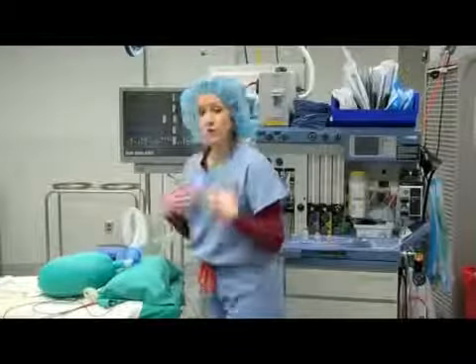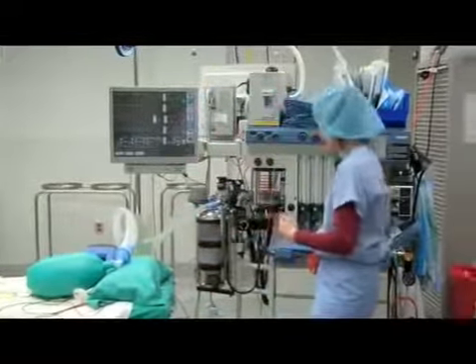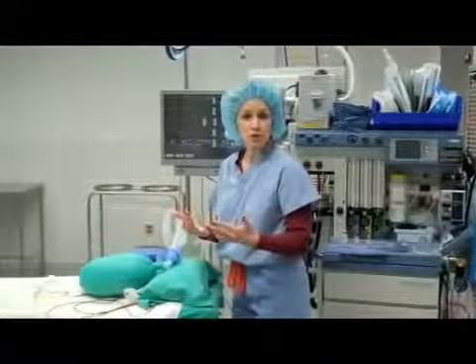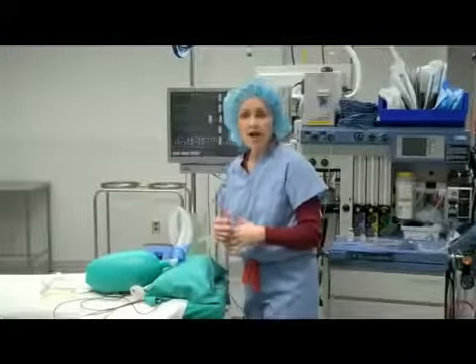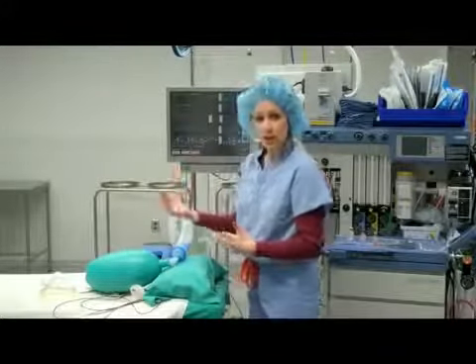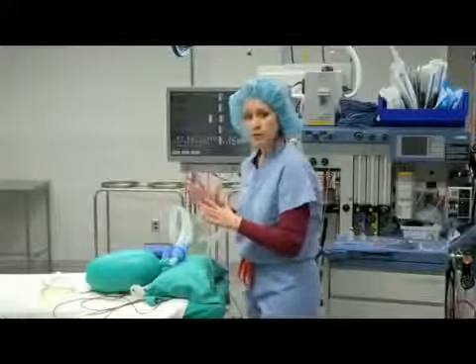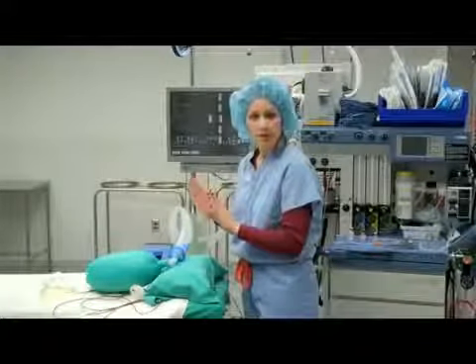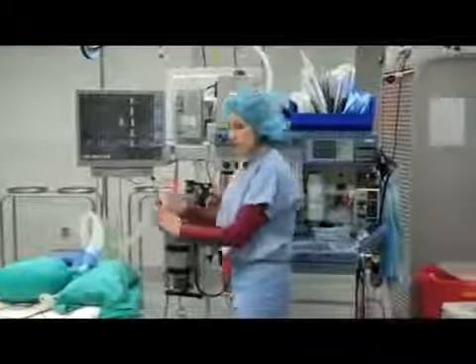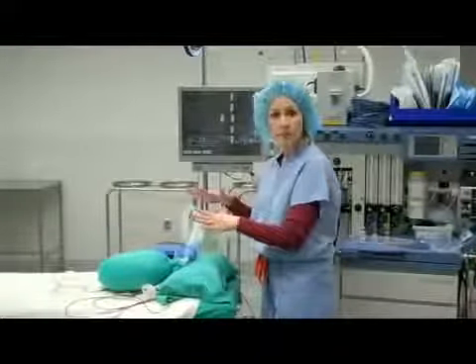Once we are nearing the end of surgery, we start tapering down the anesthesia gas. We start checking the patient to make sure that the muscle relaxant has worn off. If we need to give additional pain medications, we can at this point. But we're watching the surgeon to see exactly where he's at and how close he is to being done. Once we feel that he is just about to be completed, we shut off the gas completely. We increase the amount of oxygen being delivered to the patient because we want the gas off of the lungs. We want it to get out of the body.